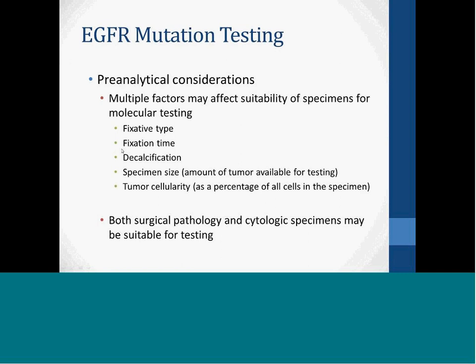Fixation time may also be a factor that impacts successful testing. Specifically, extended fixation times may result in excessive cross-linking of DNA, which may decrease the amplification efficiency for this testing. Decalcification is something that may degrade the DNA to a degree that it's no longer suitable for testing. Approximately 50% of our cases that have been decalcified are really unsuitable for testing, or the testing fails.